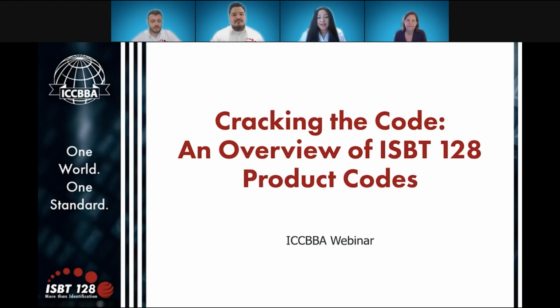Thank you, Ryan. Alex, are product codes which have been retired identified as such in the online product lookup tool? Yes, thank you for that question. They are indeed. When you're using the online lookup program, if you enter a 5-character PDC that is retired, or if you are building a product description that is also retired, it will notify you in the green result found box that you saw while we were going through our presentation today.